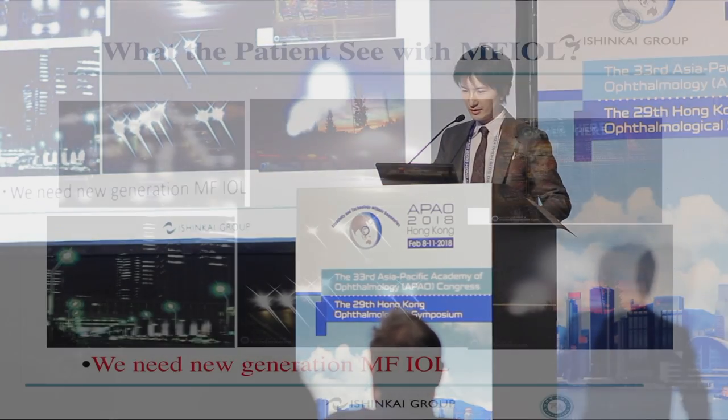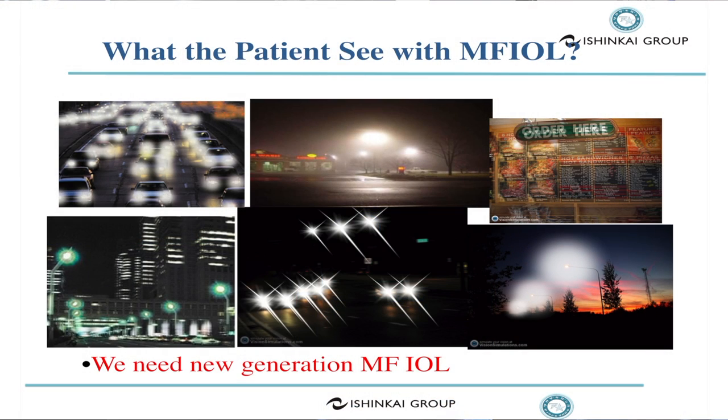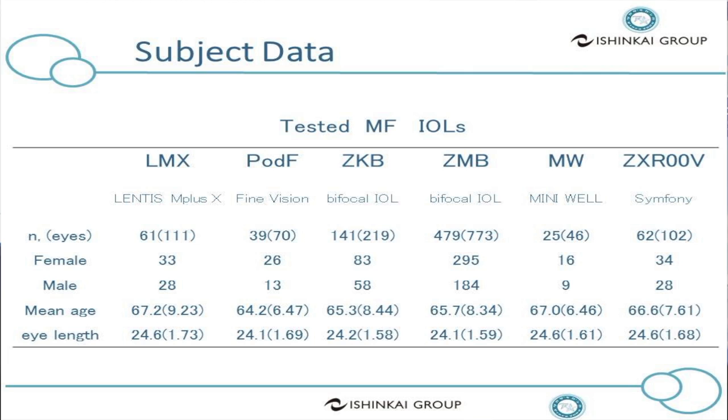What does the patient see with the multifocal IOL? You just performed a successful surgery. Your patient is 20/20, but your patient is not satisfied because of the dysphotopsia. The number of patients who actually require the IOL exchange is only about 1 in 1,000 patients. However, the number of patients complaining about the dysphotopsia is closer to 1 in 5 patients. We need a new generation IOL.